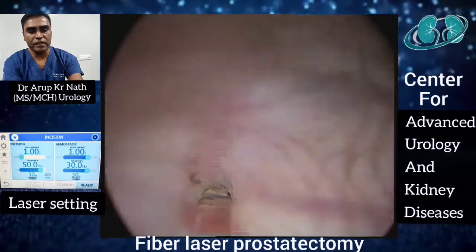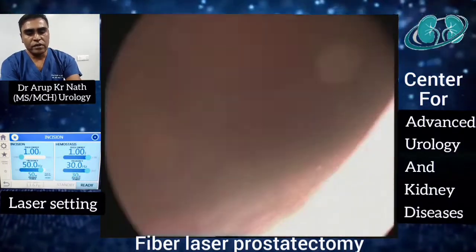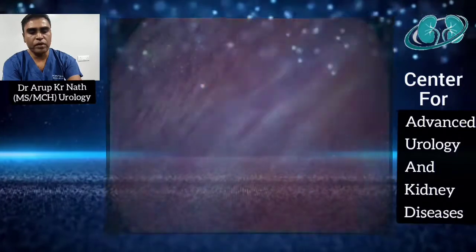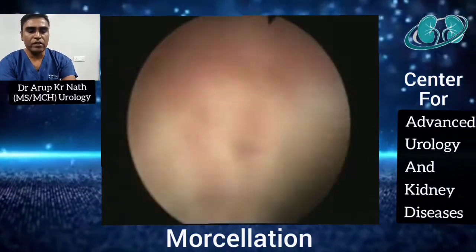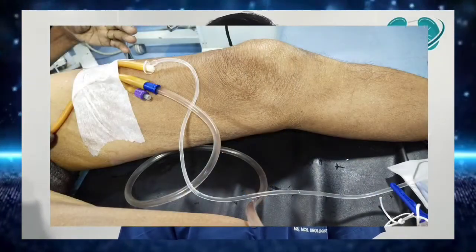This is the right ureteric orifice and this is the left ureteric orifice. You can see the floating lobes of adenomatous tissue in the bladder lumen. At this moment we change the laser scope for the morcelloscope and perform morcellation. The whole procedure took 35 minutes with 5 minutes of morcellation. After morcellation, we place a 3-way 22 French catheter and start slow irrigation. The patient resumes liquid diet after 4 to 6 hours in recovery, the catheter is removed the next day, and the patient is discharged with a follow-up appointment at 2 weeks.